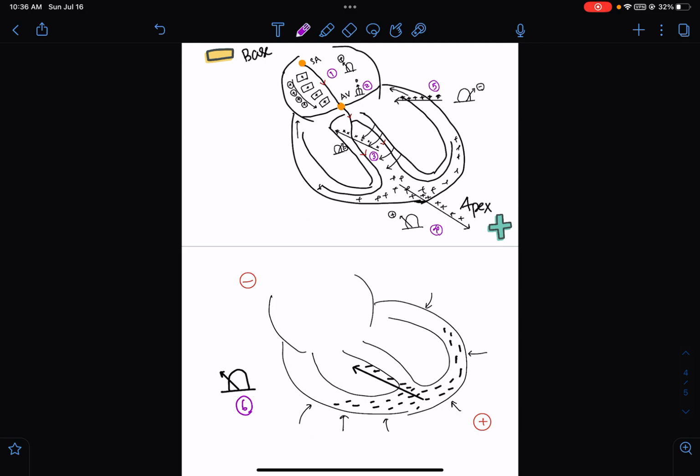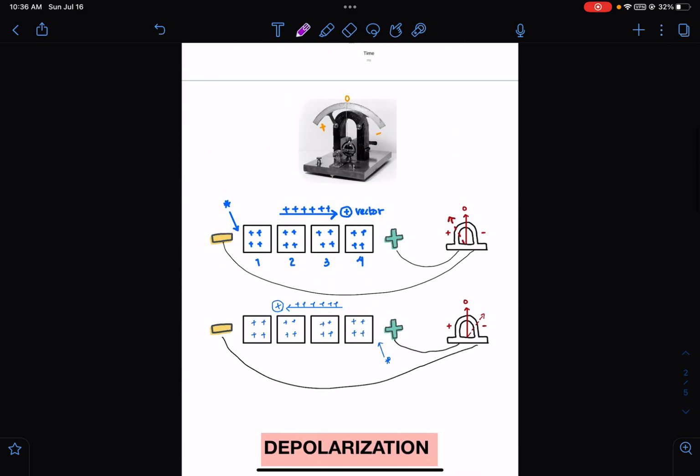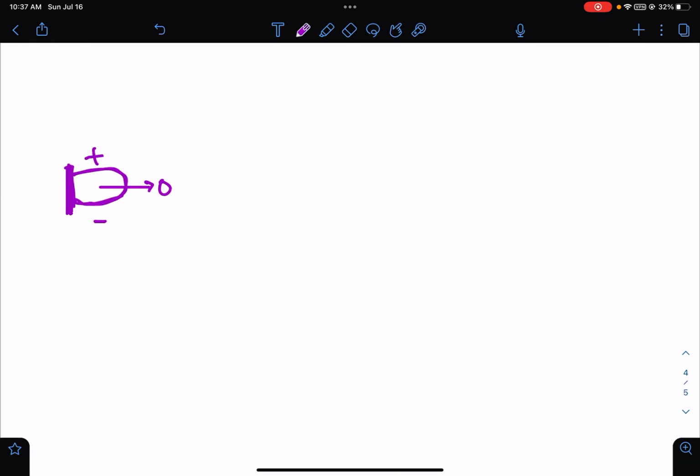So this is all about the phases of depolarizations and the repolarizations we detect on galvanometer according to vectors. Okay, so let's move on to the last portion of waveform formations, that is our PQRST wave. Okay, so here is your galvanometer. This is zero position. This is positive. This is negative, right? If we draw the waveform according to the electrical activities in the cardiac muscles.